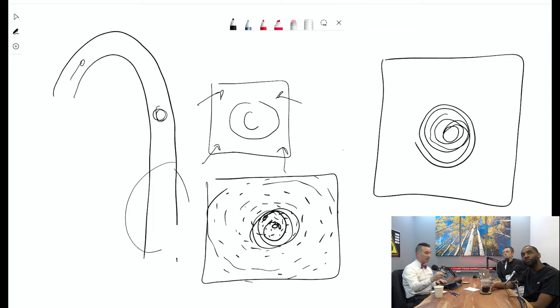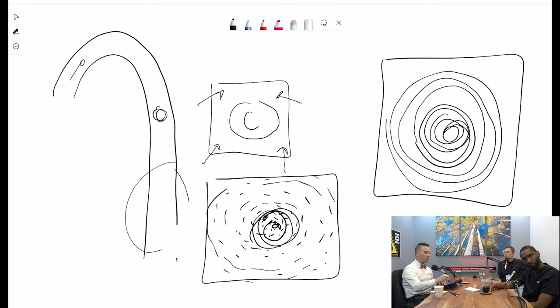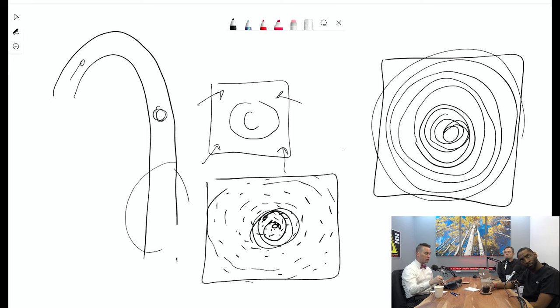Now, right here, contrast is starting to dump from the jugulars, but it's okay because we've already filled the area of k-space that's in charge of contrast. So all we do for the rest of the time, sure, this stuff is filled with venous, but it doesn't even contribute to contrast. And so we have super, super high resolution 3D contrast MRAs still for free. With a pretty good temporal resolution still too, right?